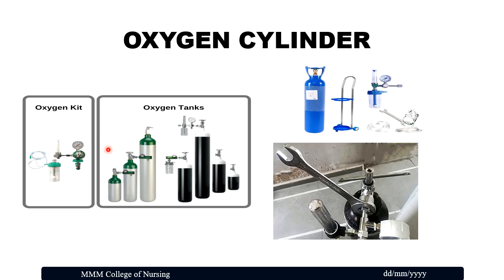And this is the oxygen cylinder. This is a kit. These are tanks. And this is a spanner with spindle and key. So this is an oxygen stand. These are the parts of the oxygen cylinder.